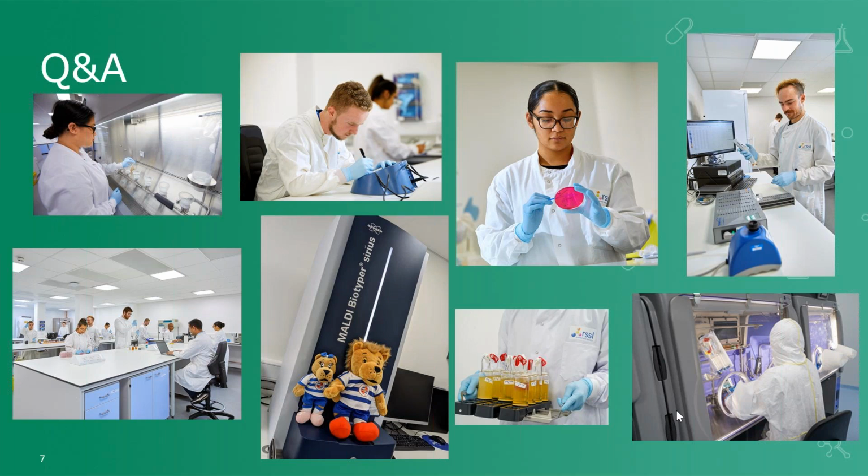But of course that's going to be dependent upon the process, the centrifugation process, or the sonication process of releasing microorganisms sufficiently into the supernatant. So that's probably to a degree process specific, but I think I would do what I could to demonstrate release of microorganisms into the supernatant and attempt the sterility test on that.